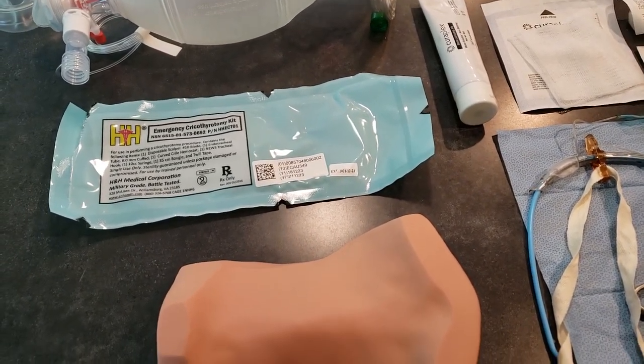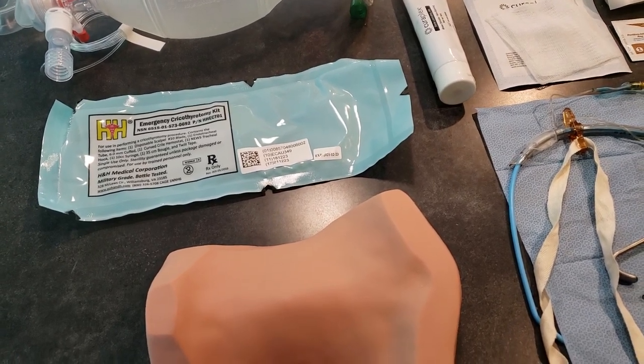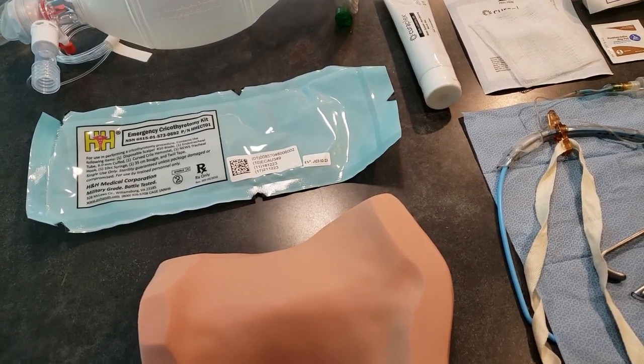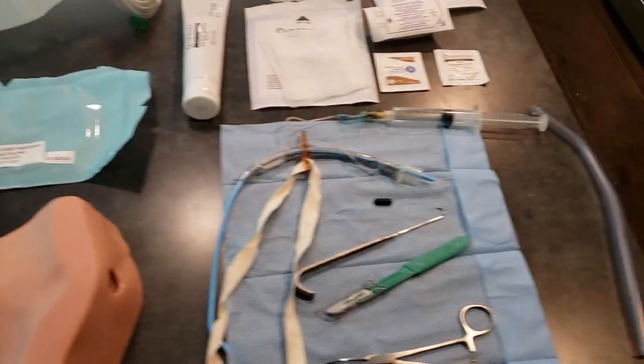You're going to need to do this when you have a total airway obstruction that's not relieved by other means, when you have severe trauma and it's compromising the airway, or any other reason that you may have the inability to ventilate, intubate, or use a supraglottic airway.